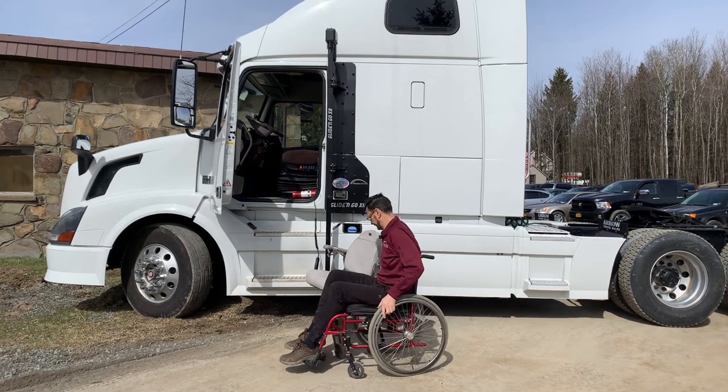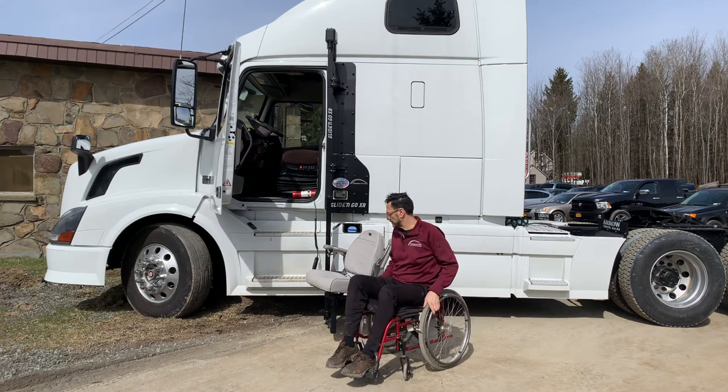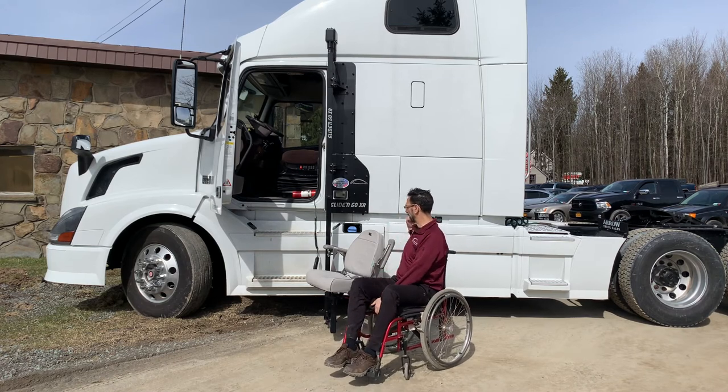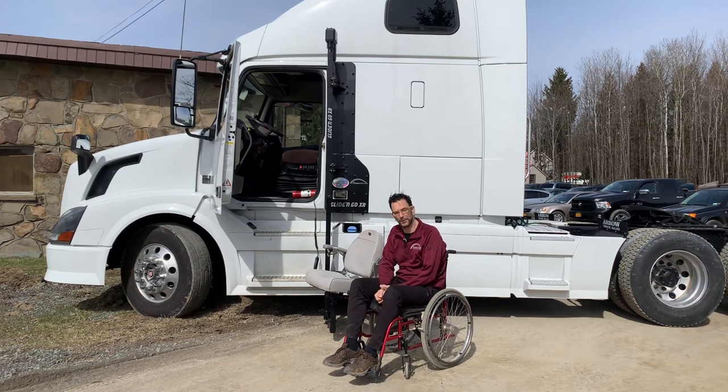Legs back in and we're ready to hit the road. When you get to your location, you can have a storage compartment, or actually what a lot of folks do — it's an exterior rated seat — you just leave the seat right on there, or pull it in, or whatever you want to do. Close your door and you're ready to hit the road.